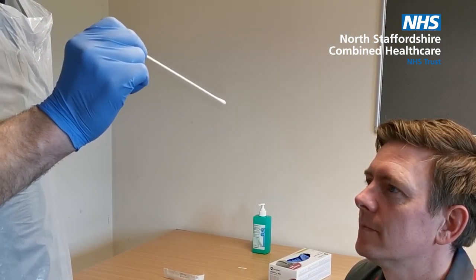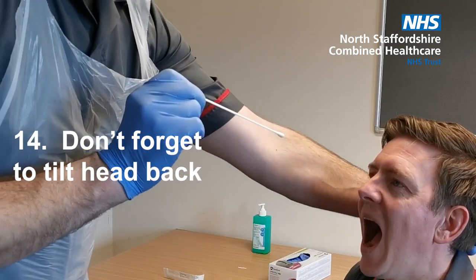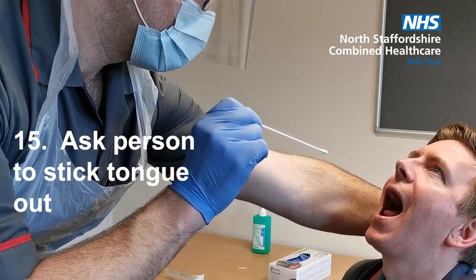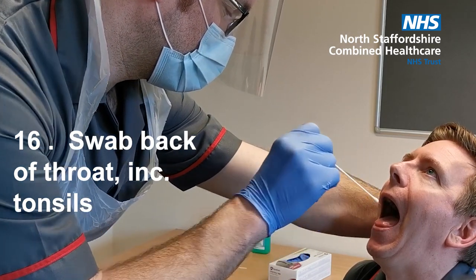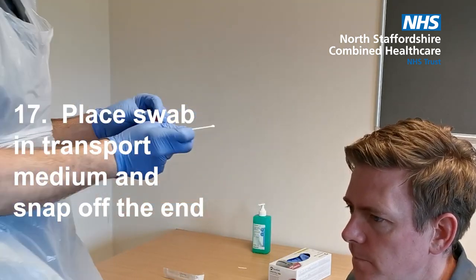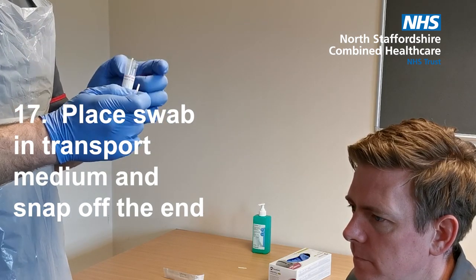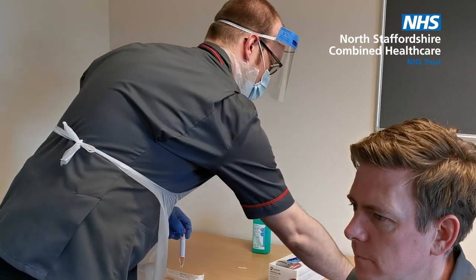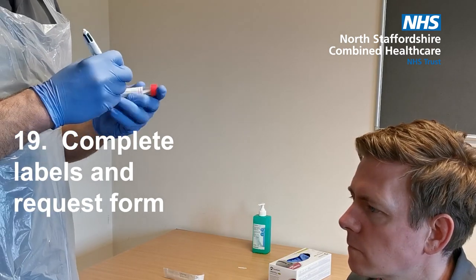Now onto the throat swab. Hold the swab at the very end. Ask the person to open their mouth and don't forget to tilt their head back. Ask the person to stick their tongue out and swab the area at the back of the throat, including the tonsils. Place the swab in the transport medium and snap off the end. Pop the lid on securely. And now for the admin — complete the labels and the virology request form.